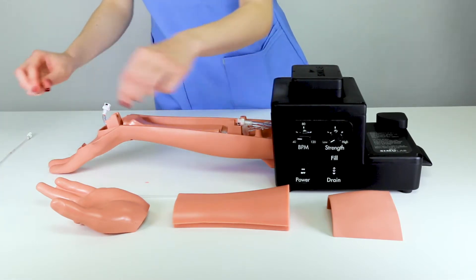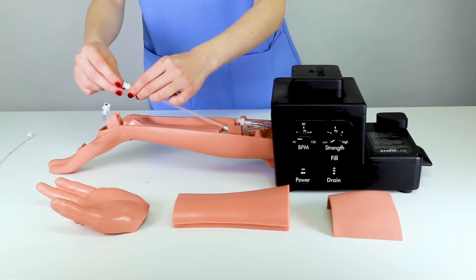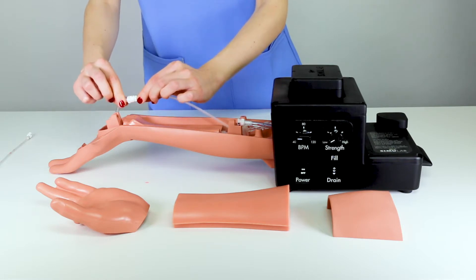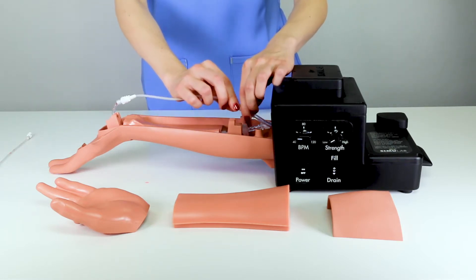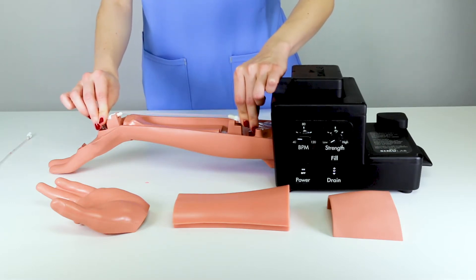Dispose of the used artery and replace with a new one. Twist the connectors clockwise until a small click is heard and felt, ensuring that the connectors are secure. Repeat on the other side and secure the artery into the stands.